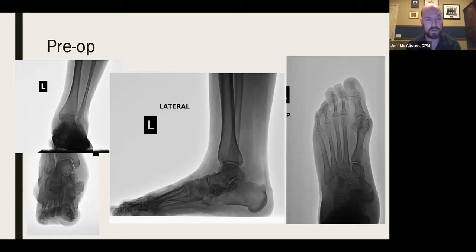But obviously, checking our radiographic ankle films, confirming that our ankle is not in valgus, right? Often we miss that and we don't control it, and we avoid looking at the ankle from the front, not just the side. So the lateral view wasn't too impressive radiographically, but clinically it's what you would imagine.